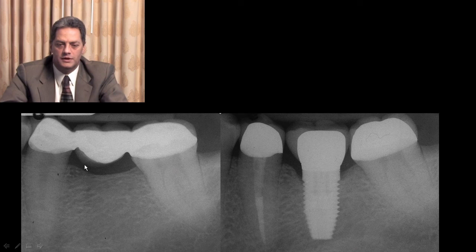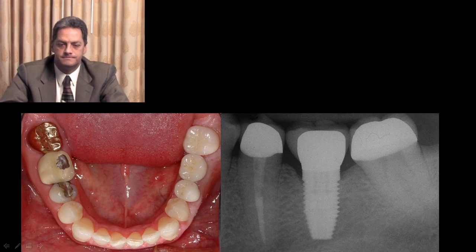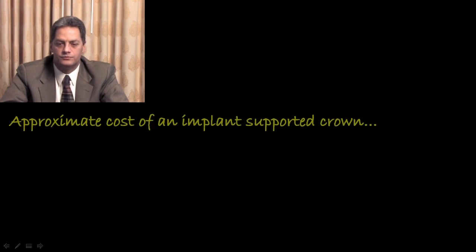So we can evaluate the initial situation from the patient and final restorations with good adaptation and an implant right in the center. Final aesthetics of the final restoration, and eventually we'll get to work on the contralateral side.